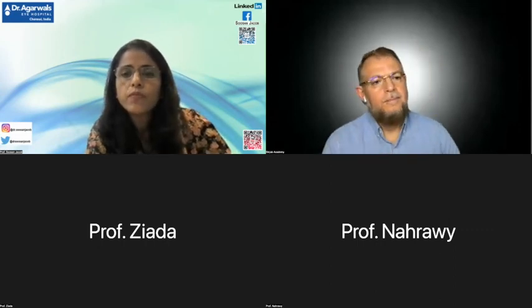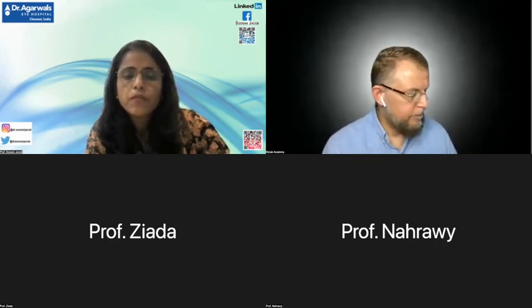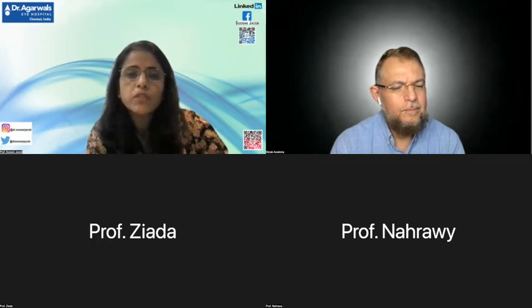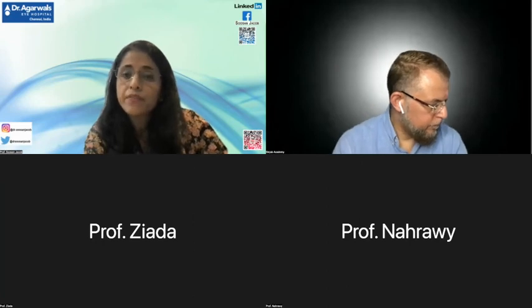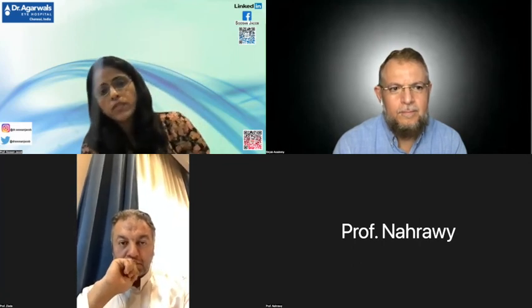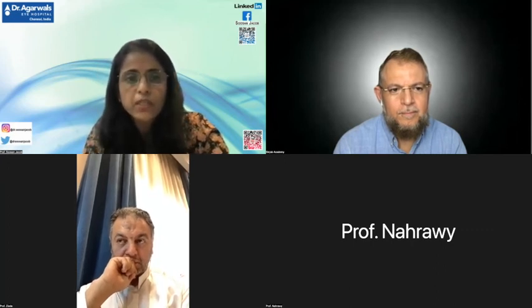It would basically be your preference. What have you been doing with ICRS so far? What are you comfortable with? If you are comfortable doing topo-guided PRK, then you can definitely go ahead and do that. Phakic IOL is another great option, and that's really nice because sometimes in patients with irregular astigmatism, you can make it more regular using CAIRS and then put in a phakic IOL, which will give you much better effects than directly putting in a phakic IOL. You can combine it with refractive lens exchange. You can combine it with conductive keratoplasty, though it's not being done much around the world at all. You could possibly do that if anyone still has that machine. So there's nothing to stop you from combining it with anything actually.